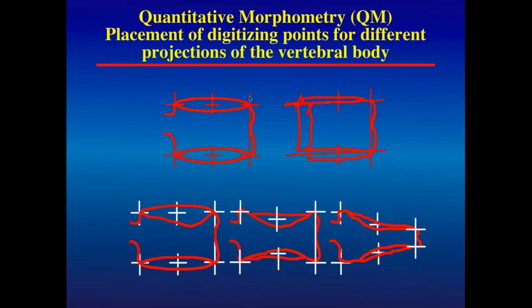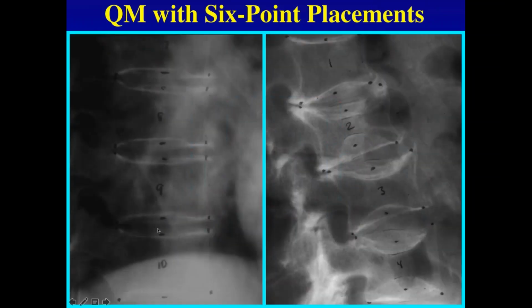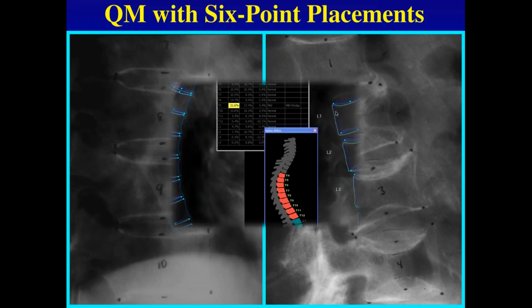Now, I've mentioned the morphometry. This approach has been used in many of the clinical trials, generally combined with a semi-quantitative scoring, but it has problems, not so much with a normal spine because you can mark the points readily, but as you get into the elderly population with scoliosis and multiple osteophytes, etc., the methodology becomes more complicated and less reproducible.